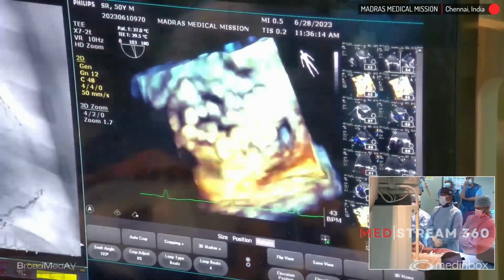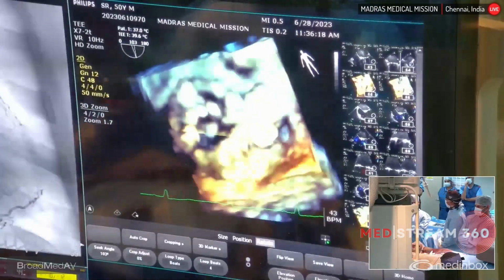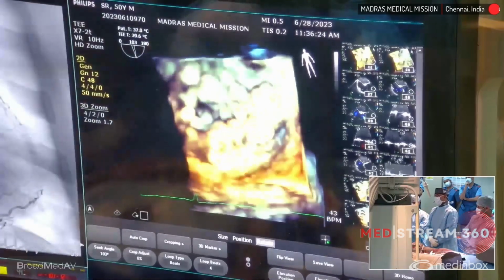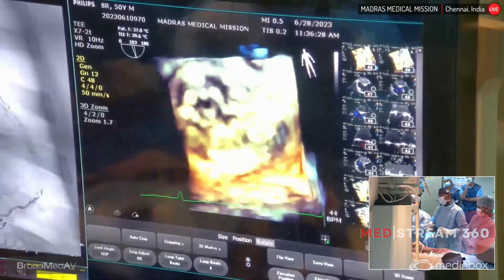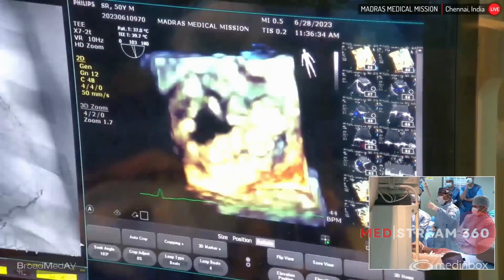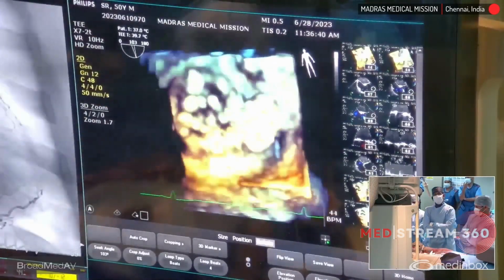the 8 millimeter. Leak was originally looking a little crescentic or oval with a long axis dimension of around 11 to 12 and a short axis dimension of around 8. And so probably these two devices are plugging it in the appropriate position. In fact, now the 3D is also showing the valve leaflet mobility. The valve leaflet, the direction of movement is actually perpendicular to the devices. It's opening and closing in an anteroposterior plane. We are satisfied with the result.